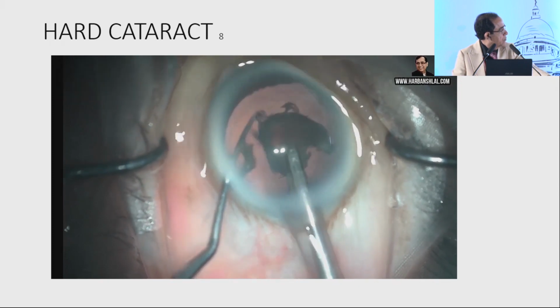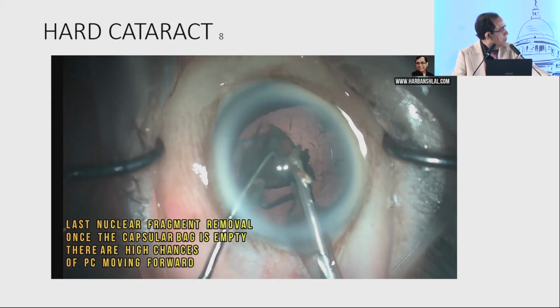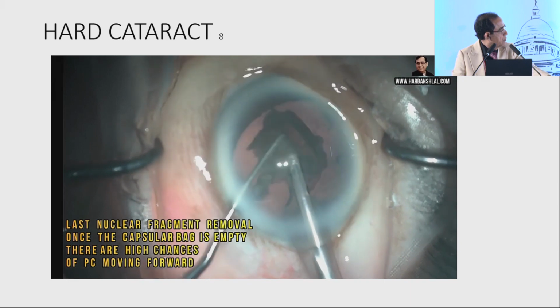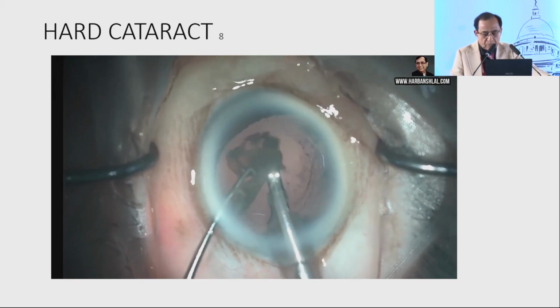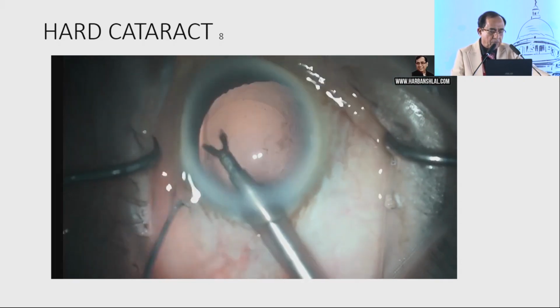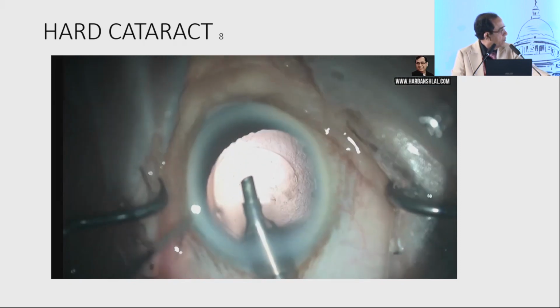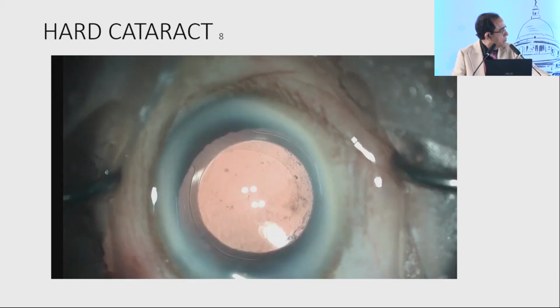Now we have come to the removal of the last fragment, and this time the posterior capsule and cornea, both of them are highly vulnerable. We lower the vacuum setting to 400 and use the chopper to keep the fragment in front of the tip and away from the cornea. That rhexis is larger nasally and onto the left-hand side. Day 1, the patient had an absolutely clear cornea and 6/9 vision.